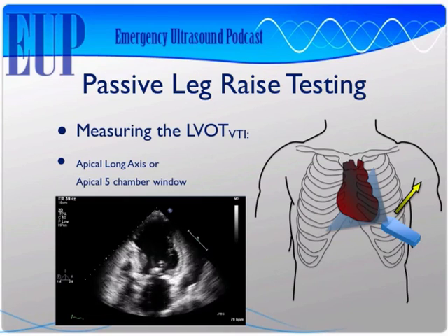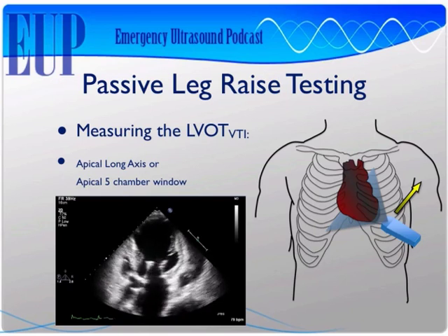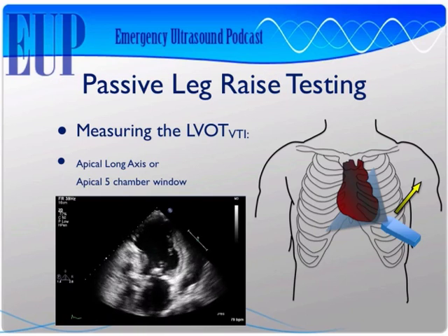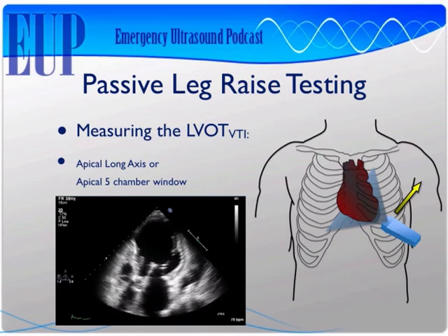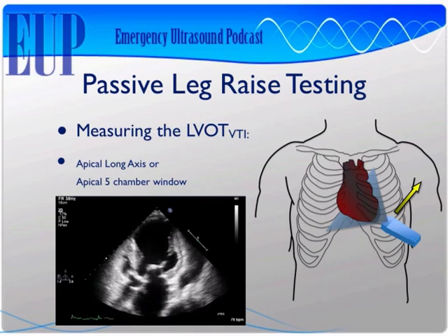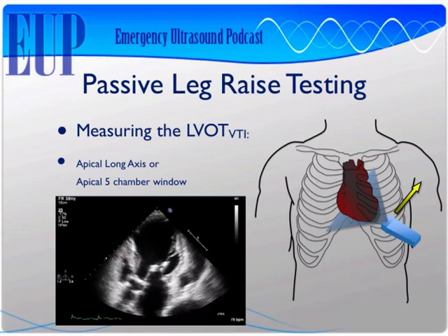Now we've got to find the distance part of the equation, and that's the left ventricular outflow tract VTI. VTI stands for velocity time integral. The velocity time integral is basically the area under the curve of all the red blood cells that are flying through the aortic valve, right? So what we do is we get an apical window. I'm going to put the probe at the apex of the heart, and I'm going to get either a five-chamber window or an apical long axis.